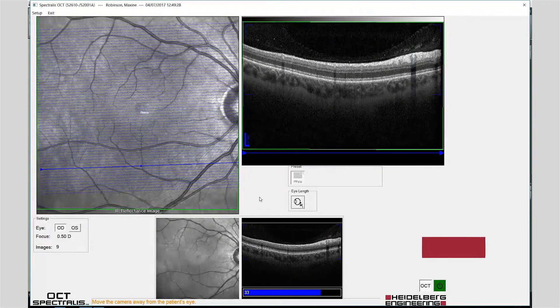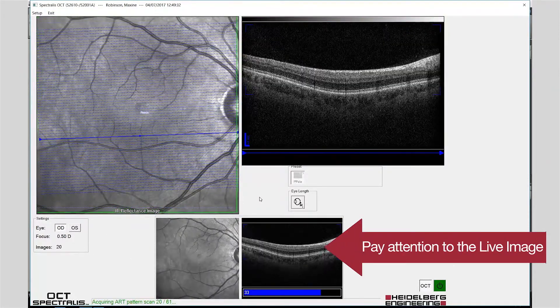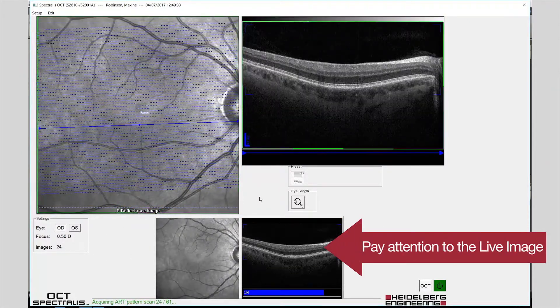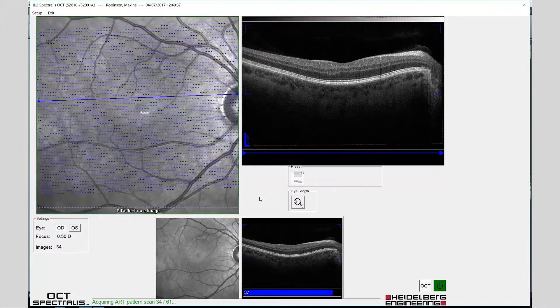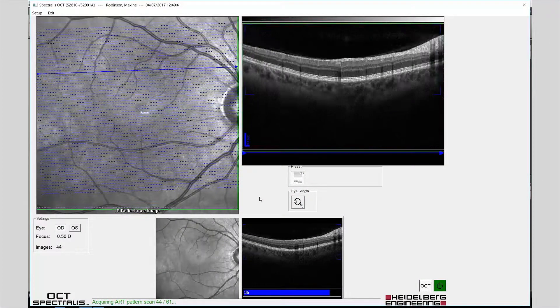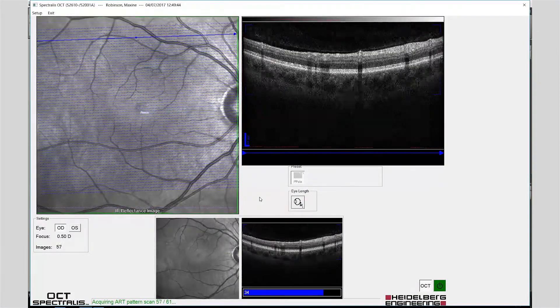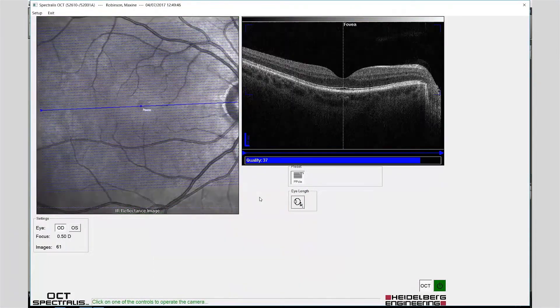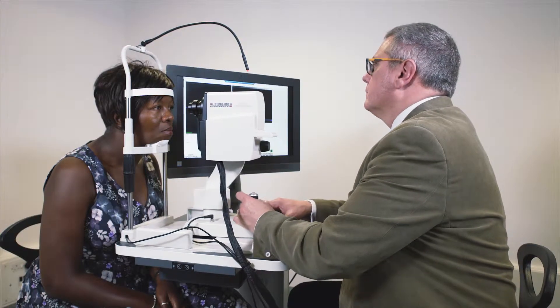The position of the scan should be monitored throughout the image acquisition process and adjusted for correct position by using forward or backward movement of the joystick. Move the camera head to align with the fellow eye and repeat the scan procedure.